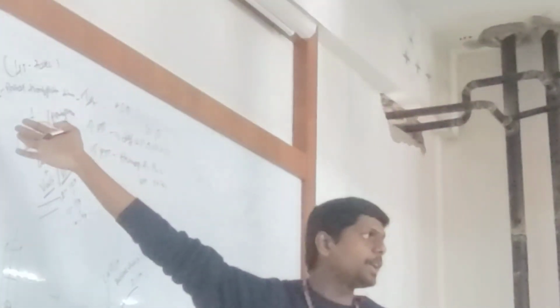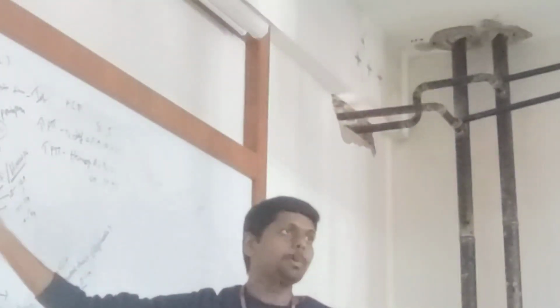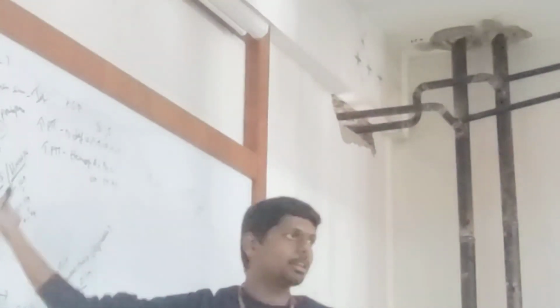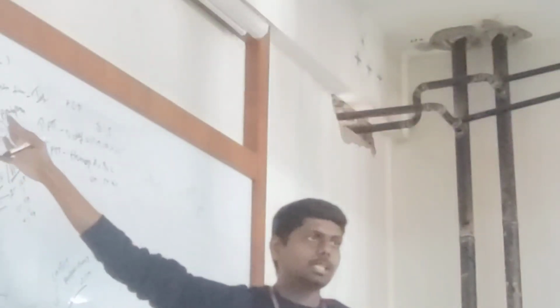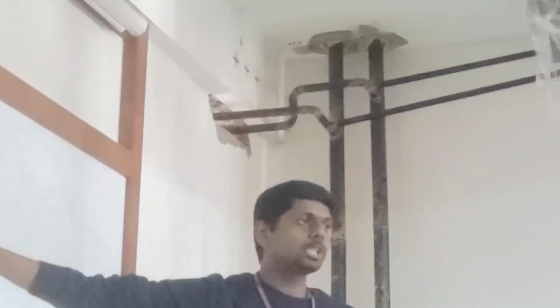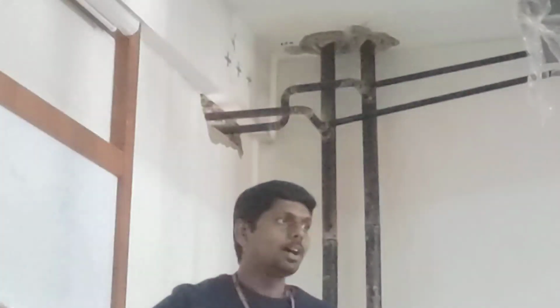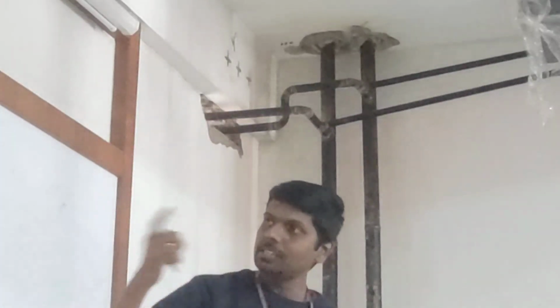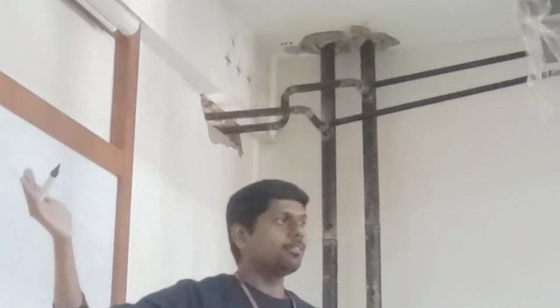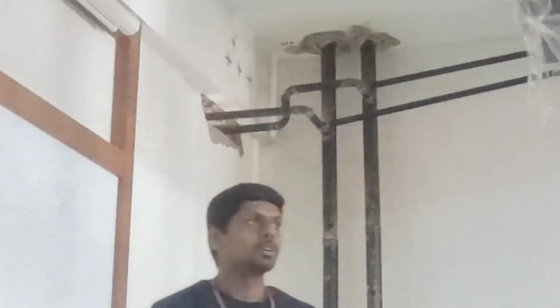Previously we went with PTT studies, but recently we converted to APTT studies because APTT is more reliable, more accurate compared to PTT. That we'll see. These two tests are important for your lab also outside. We will perform PT and APTT regularly in patients. Apart from other things like TGT and TT, they will be easily understood. Okay.